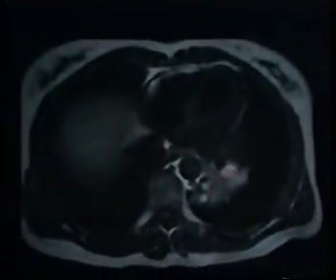This is obviously an intralobar pulmonary sequestration. And how could you doubt that? And here are the dilated bronchi within. And what I walked right past was this finding of what is, in fact, an anomalous vessel to the right lower lobe, which, frankly, you can make out, although I think you'd have to be quite bright to pick up that this is an anomalous vessel on the CT that's not enhanced.